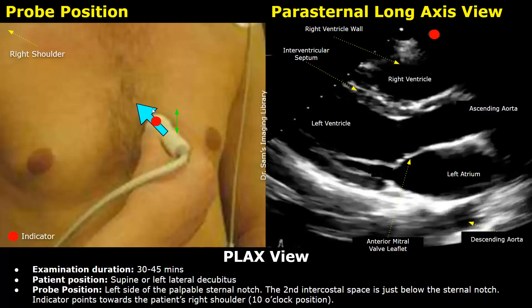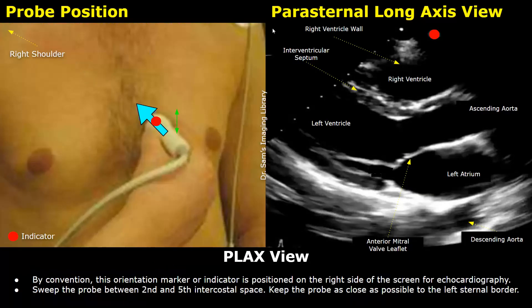This red dot is the probe indicator or orientation marker. The indicator must face the patient's right shoulder — the probe is in a 10 o'clock position. In echocardiography, the indicator is present on the right side of the screen, which is opposite to standard ultrasound where the indicator is on the left side. Make sure the indicator is on the right side before starting the scan. Sweep the probe between the second and fifth intercostal spaces while keeping it close to the left sternal border to get this image.